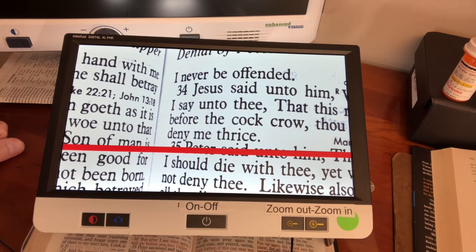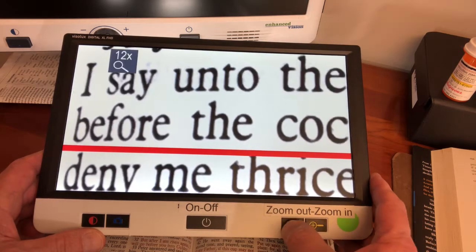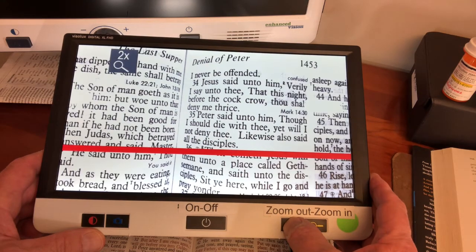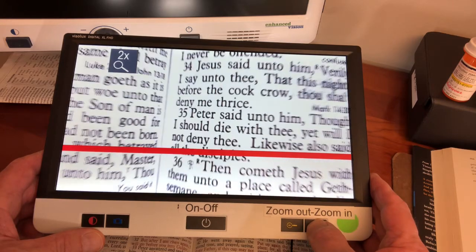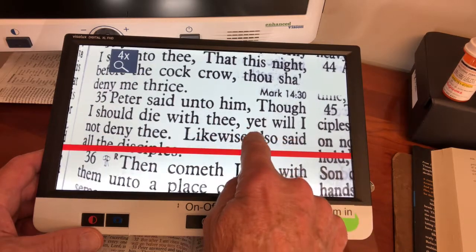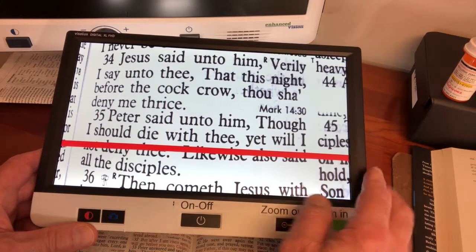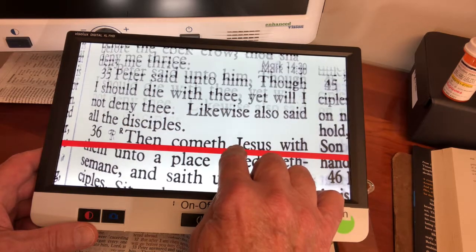This electronic magnifier is called the Visulux Digital XL FHD, also from Eschenbach. As you can see, it has a larger screen — this is a 12-inch screen, compared to the 5-inch screen on the previous one. In addition to the larger screen, there are other advantages. You can zoom in and zoom out, with magnification ranging from 2x to 12x. One very nice feature is that as you're reading, you can move the text along and line up the red line below the line you're reading, which works out very nicely.